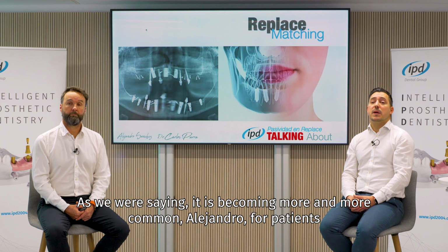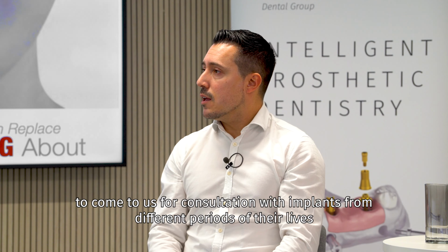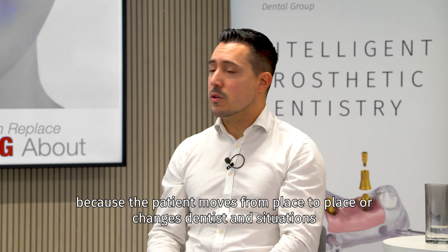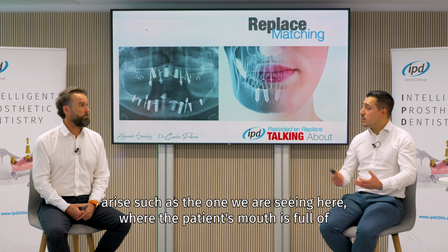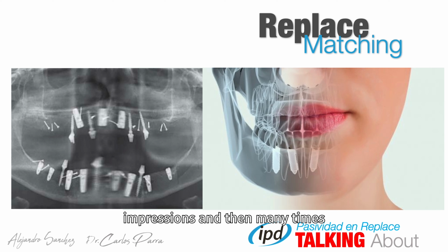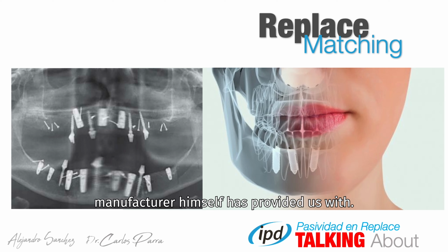As we were saying, it is becoming more and more common, Alejandro, for patients to come to us for consultation with implants from different periods of their lives, or sometimes performed in different clinics, because the patient moves from place to place or changes dentist, and situations arise such as the one we are seeing here, where the patient's mouth is full of a compendium of brands, models, different connections, and we have to take impressions. And then many times we require or we use scan bodies that we already have in the office or that the manufacturer himself has provided us with.